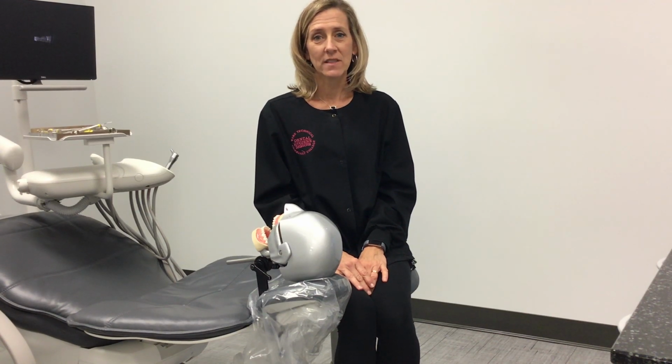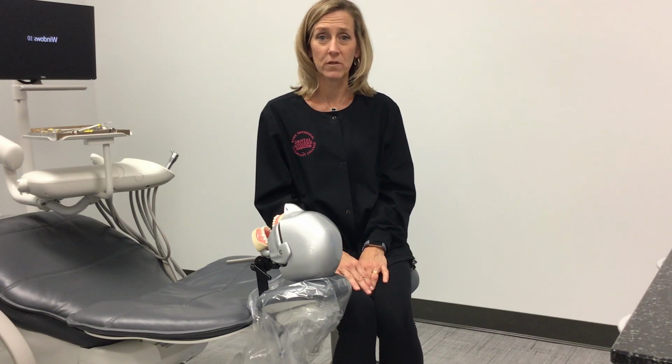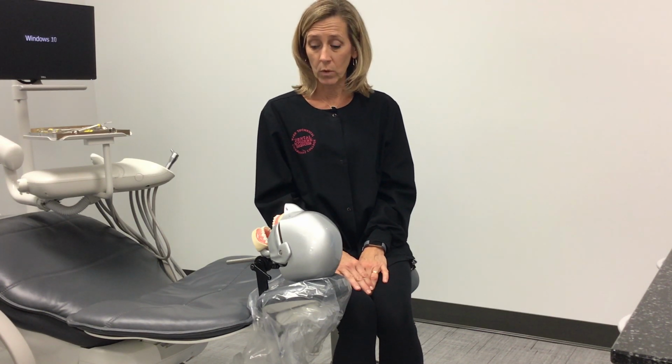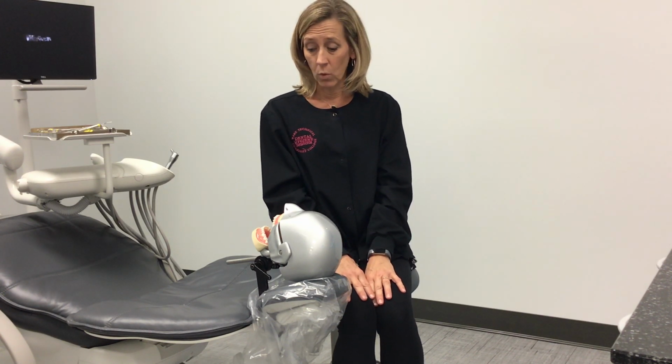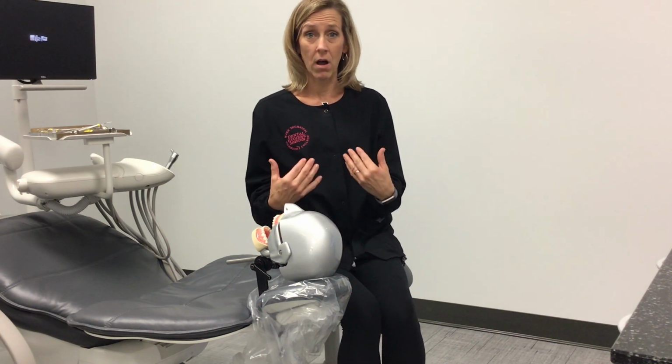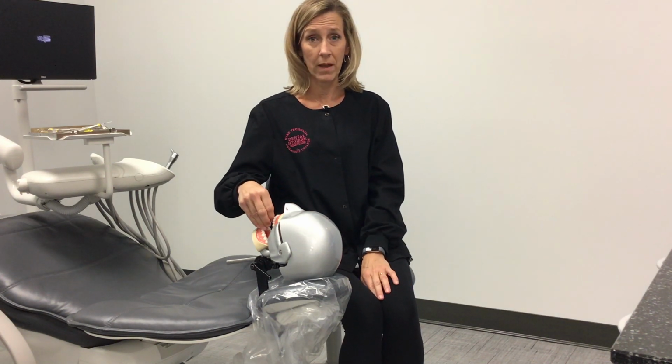This video is to clarify some questions about the mandibular anterior surfaces toward you. We want to discuss two different positioning options for toward surfaces. One option is to sit at 8 o'clock, and that's where I'm sitting now. Depending on your arm length, your 8 o'clock may be where I am.